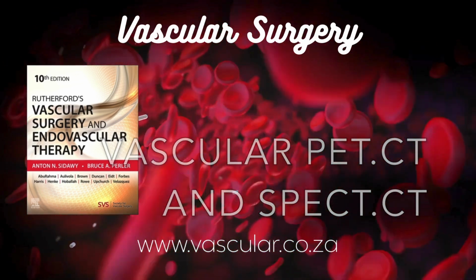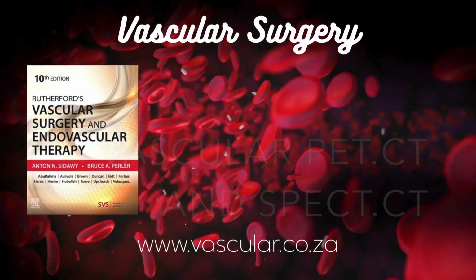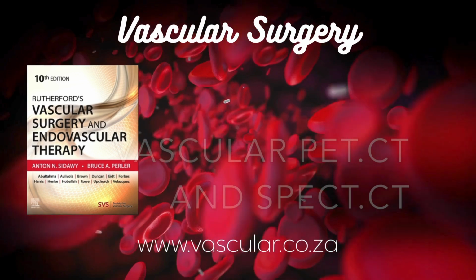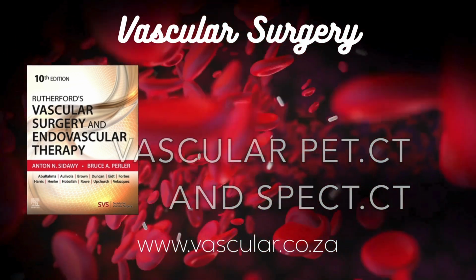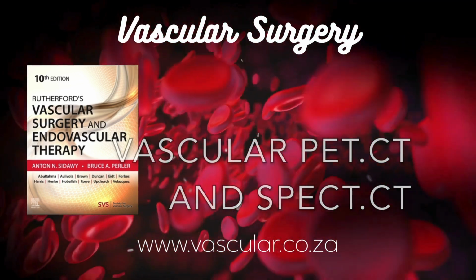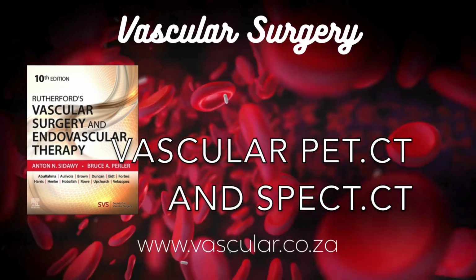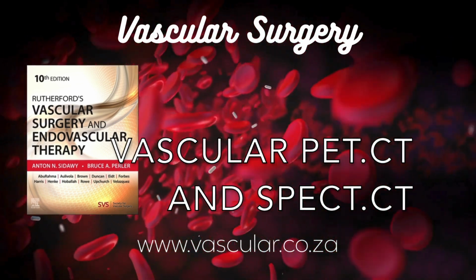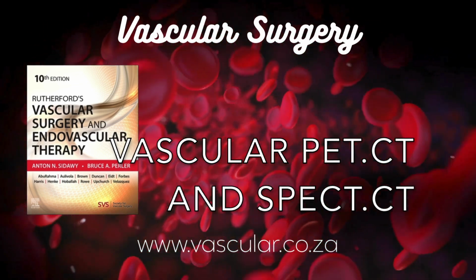And radiation? Yes, that's always a consideration. Both SPECT/CT and PET/CT involve radiation exposure from the injected tracer and from the CT component. How much are we talking about? The doses vary, but an FDG-PET/CT scan might give an effective dose somewhere in the range of, say, 5 to 20 millisieverts, depending on the protocol and the CT part. That's roughly equivalent to a few years of natural background radiation.